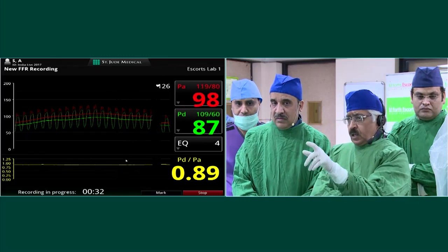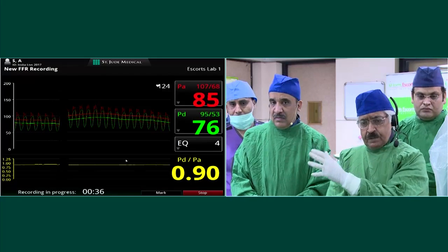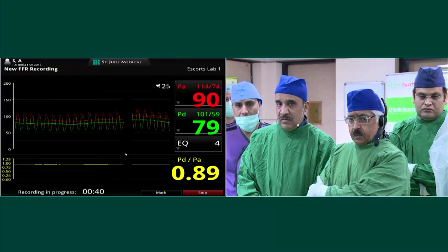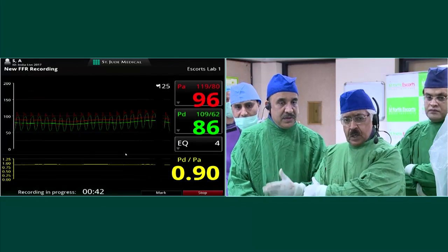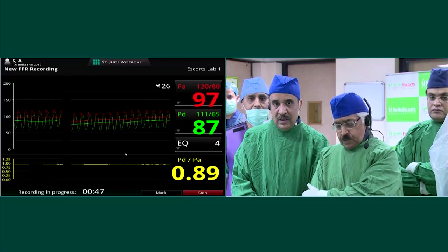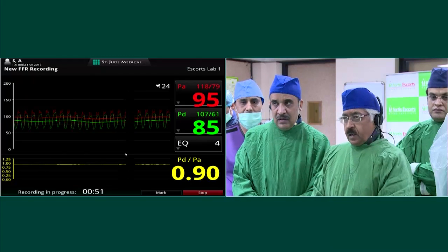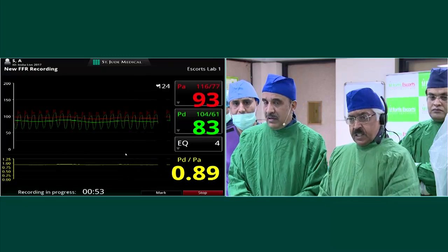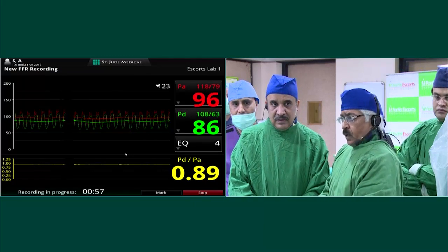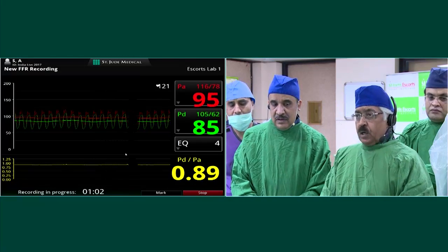By the way, the slow flows have disappeared. I'll show you that also. You can see that it's just sticking at 0.89. Now we're a minute and 8 seconds into infusion, and we're not shifting from 0.89 to 0.9. So I'm going to now do the pullback.